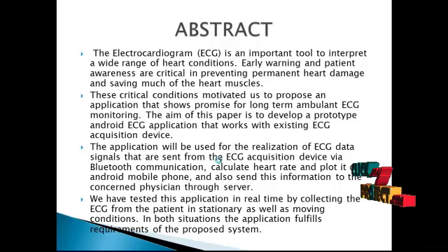millivolt on the y-axis as 1 cm, and 25 mm on the x-axis per second. We can also use faster paper speeds, for example, to resolve the finer detail of the ECG. One small block of the ECG paper translates to 40 ms.